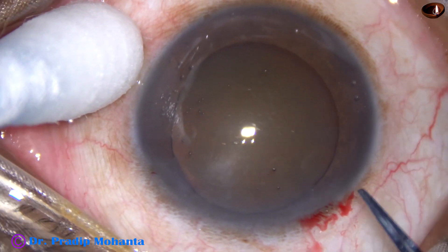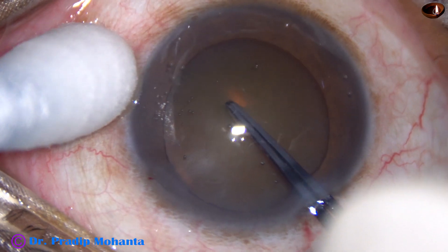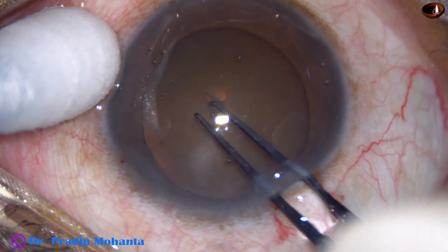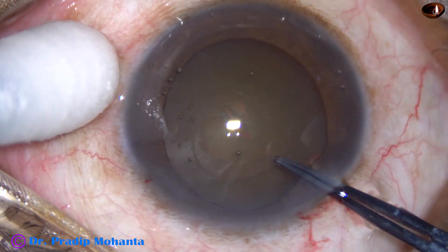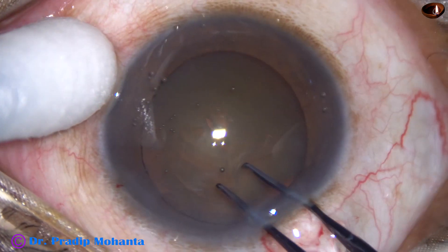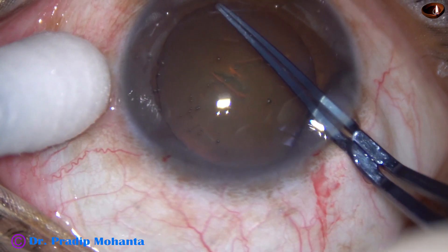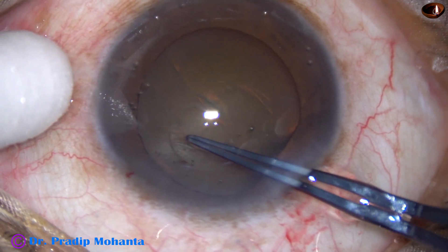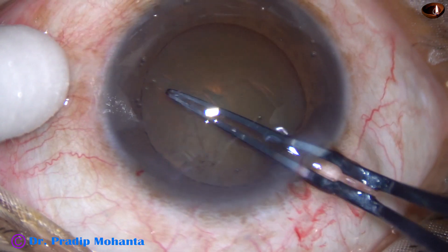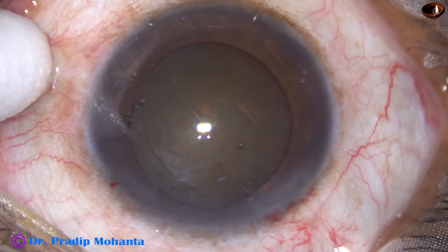Capsulorhexis is to be done. This is utrata forceps. Make a puncture with the utrata itself, hold the capsule, go anticlockwise, and do a continuous curvilinear capsulorhexis. Remain at a certain distance away from the margin of the dilated pupil to get a fairly round one.